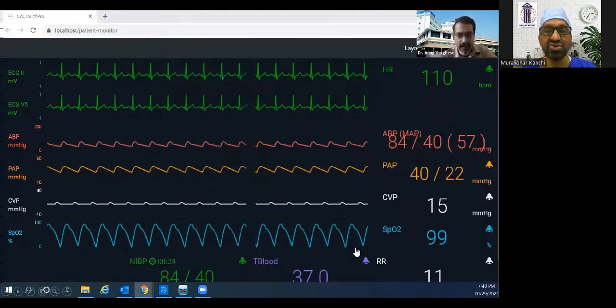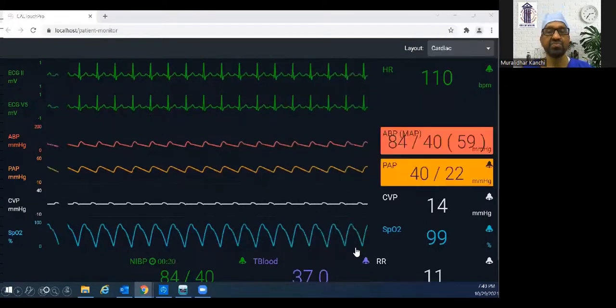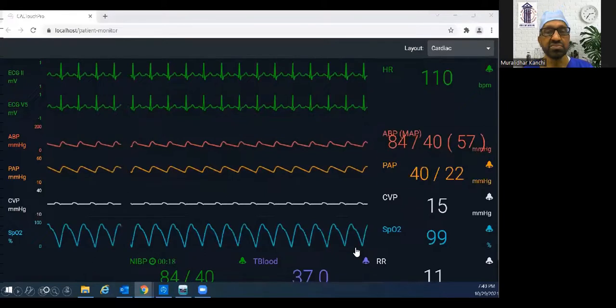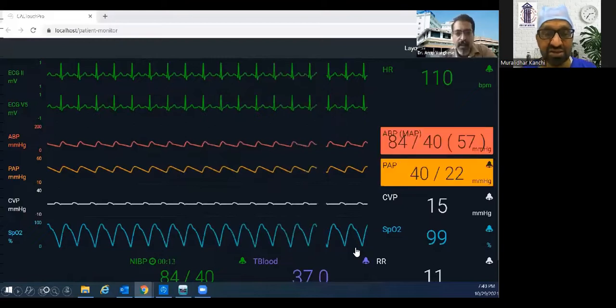As the trainee suggests the treatment, that particular treatment is given. There is a question on TEE intraoperatively. So the particular treatment is provided and the effect of treatment on the hemodynamics is demonstrated on the monitor.